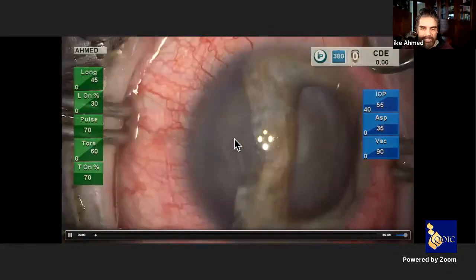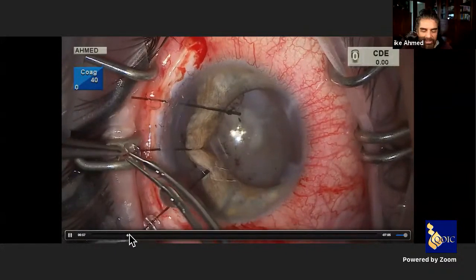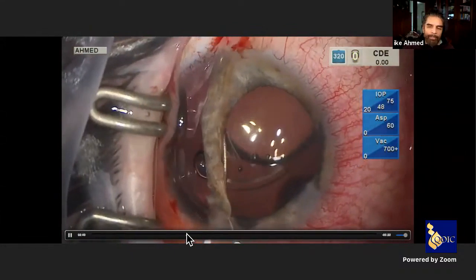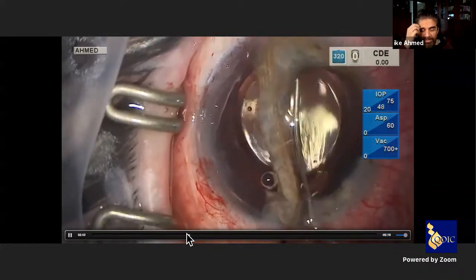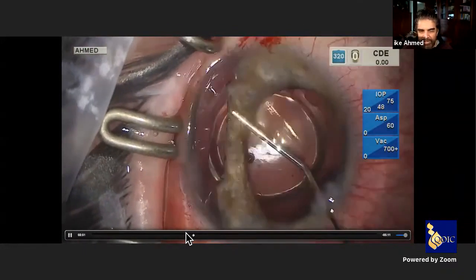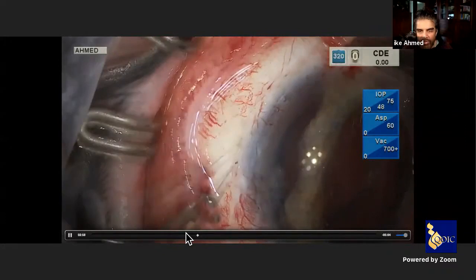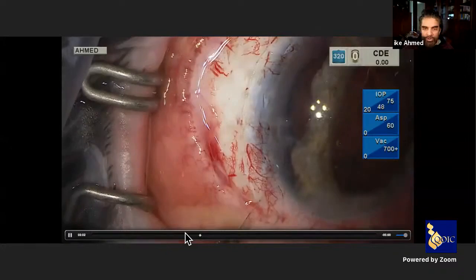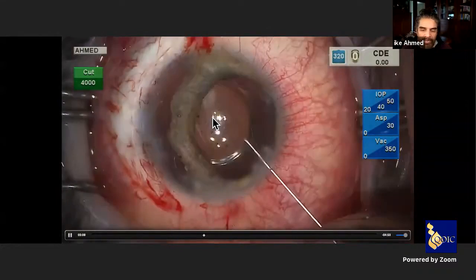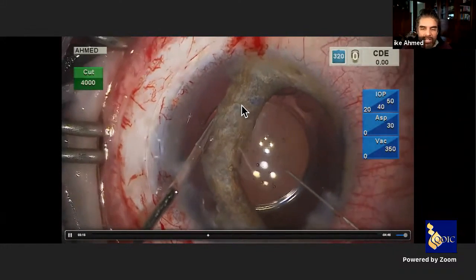Finally, this patient has a large iridodialysis with cataract. We take care of the cataract first — placing iris hooks to keep the iris away from the field, applying vision blue, performing capsulorhexis, and placing the IOL in the bag after routine cataract surgery. We then address the large almost five-clock-hour iridodialysis. It is good to address these cases within two to three months of the trauma to avoid fibrosis. We make a groove behind the blue zone of the limbal area and use a straight STC-6 needle for iridodialysis repair, placing mattress sutures.